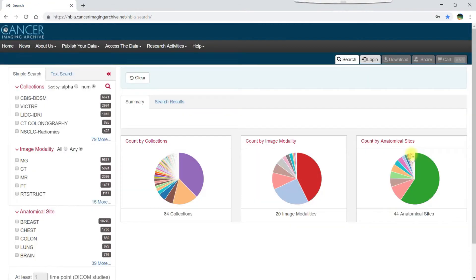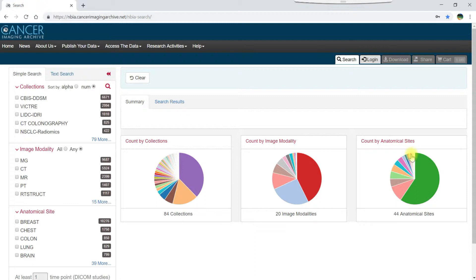Note that while the majority of TCIA data is open access and available without logging in, a small subset of collections is hosted under temporary embargoes or is restricted to certain groups of approved users. If you need to access a restricted data set, click the login tab to register for a data portal account.